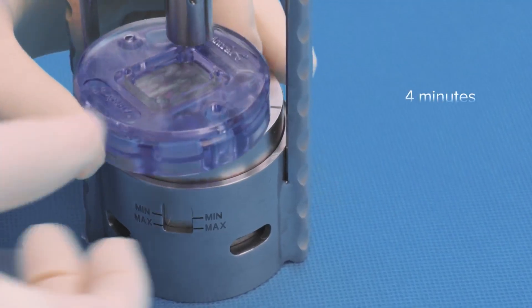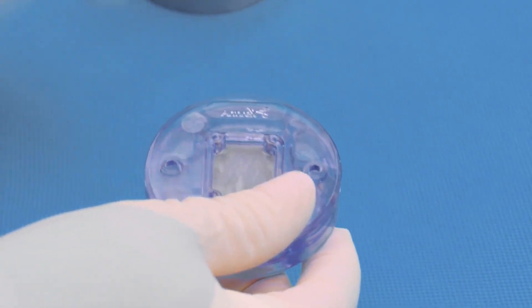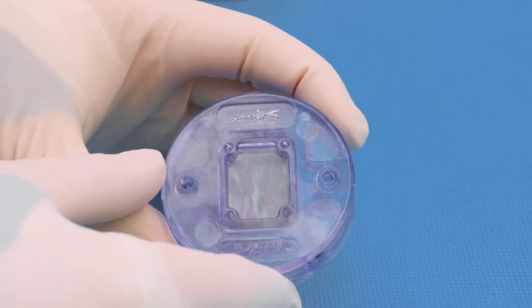After a minimum of 4 minutes, the plates can be removed from the press. The graft will be approximately 22 mm by 27 mm.